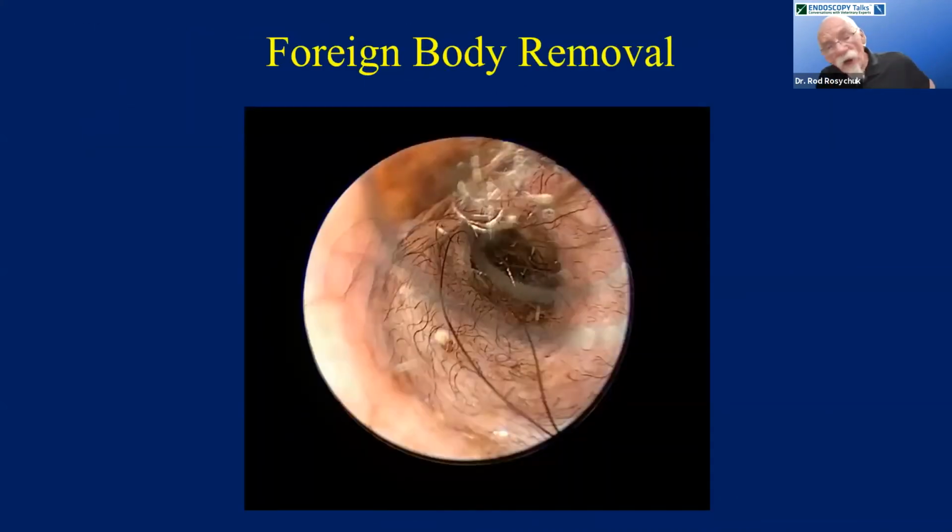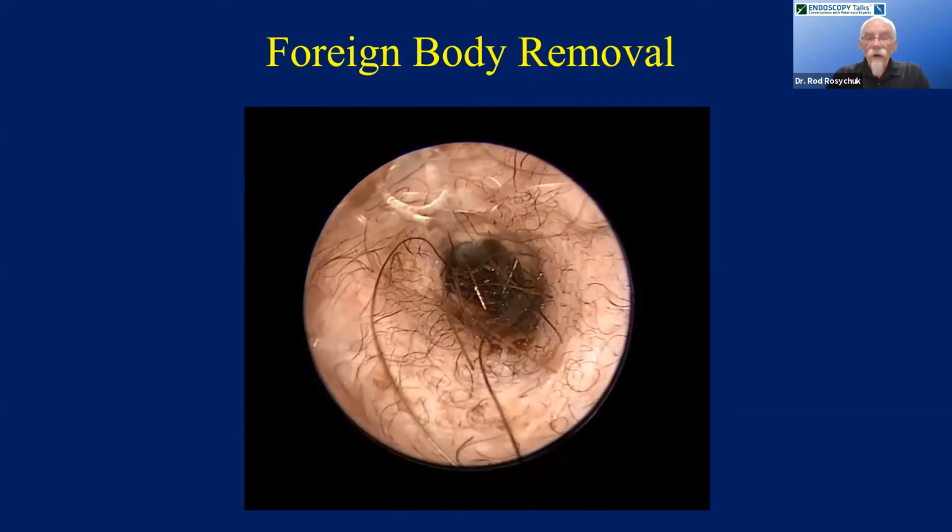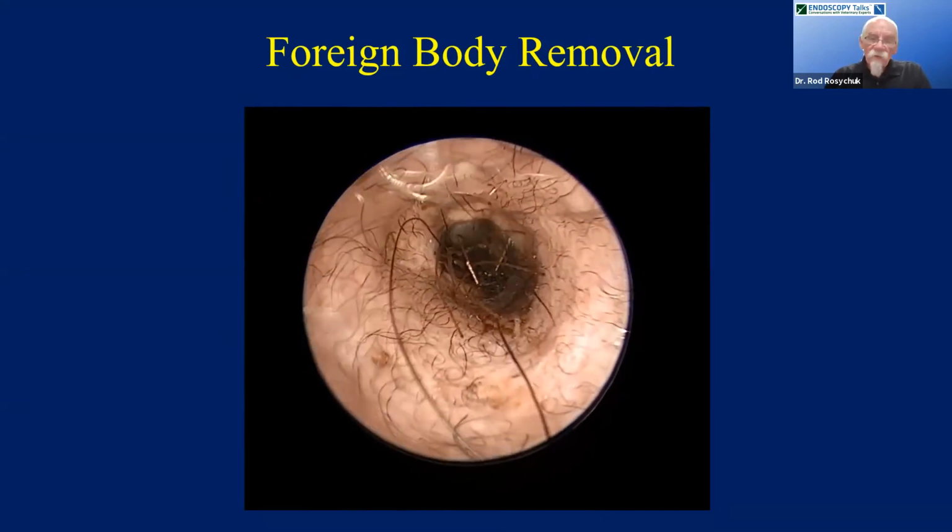As far as actual procedures are concerned, what do I use my video otoscope for in our area? Well, this time of the year, we're taking grass awns out of ears for many tractable individuals. You can do that just by holding individuals down in lateral recumbency. We have the advantage of having students around. You put five people around a tractable individual and you don't need any sedation, and you can do a good job. But where you don't have those hands, reasonably light sedation is often enough to allow us to do the foreign body removals that we need, in this case, grass awns.